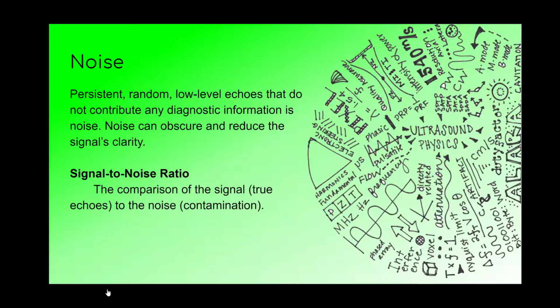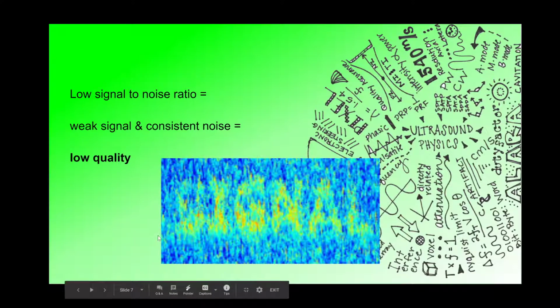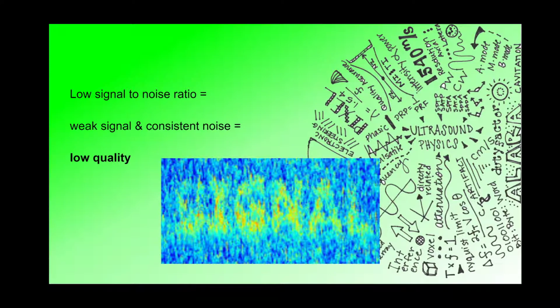And so we can think of the signal to noise ratio as an important concept for us being able to see the structures better in the body. The signal to noise ratio compares the true echoes coming back from important structures within the body versus the noise, the contamination that's in our image. When we have a low signal to noise ratio, that means we have a weak signal but consistent noise. That noise is always there, but we have a weak signal going along with it. And because of that, we're going to get a low quality image.